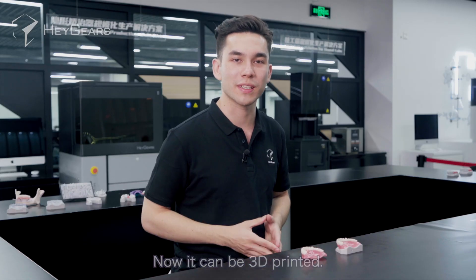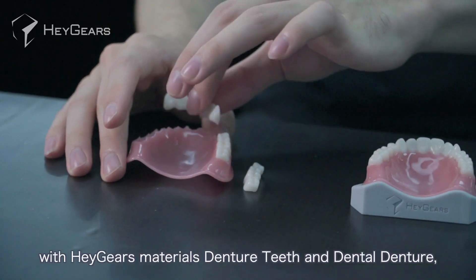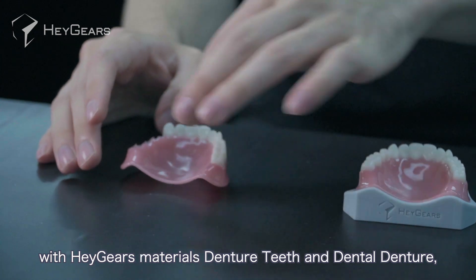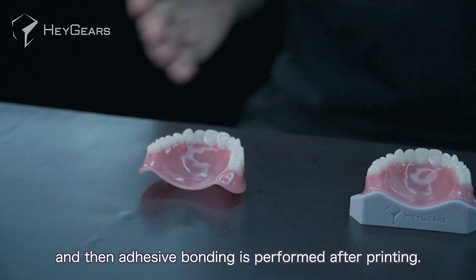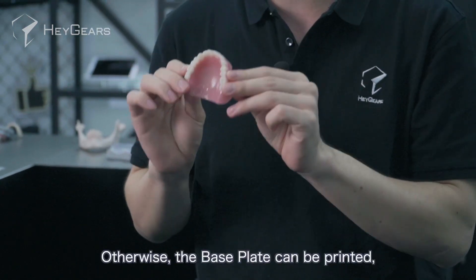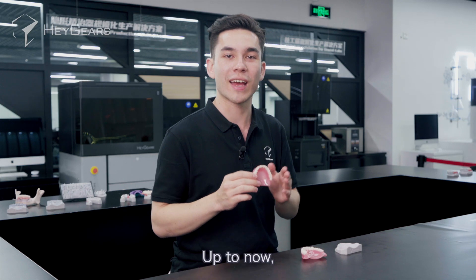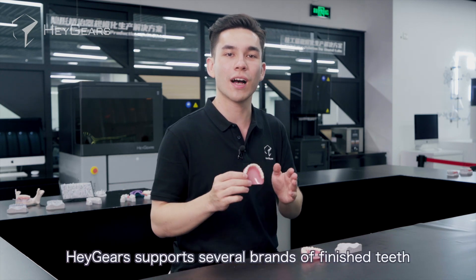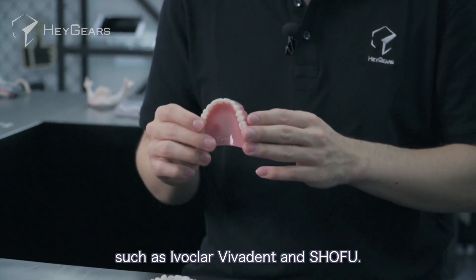Now it can be 3D printed. Denture and base plate are printed separately with HeyGears materials — denture teeth and dental denture — and then adhesive bonding is performed after printing. Otherwise, the base plate can be printed and the dentures can be bonded to the base. Up to now, HeyGears supports several brands of finished teeth such as Ivoclar Vivadent and Shofu.